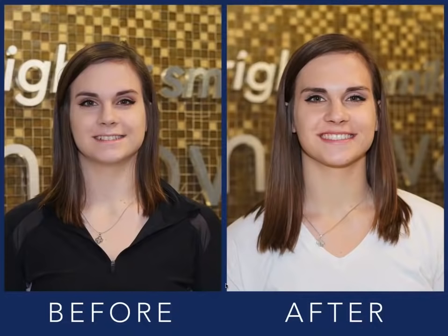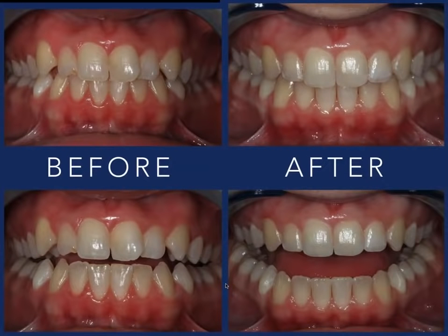This one has some rotations. This has quite a bit of crowding in the anterior. We'll go to the close-up here so you can see before and after. There are some rotations and tipping, some minor crowding. But I've had patients like this come to my practice and say they've been told they couldn't do Invisalign. It's kind of shocking, but I'm sure a lot of people who have provided clear aligner therapy have heard that before or have seen consultations that said similar things.